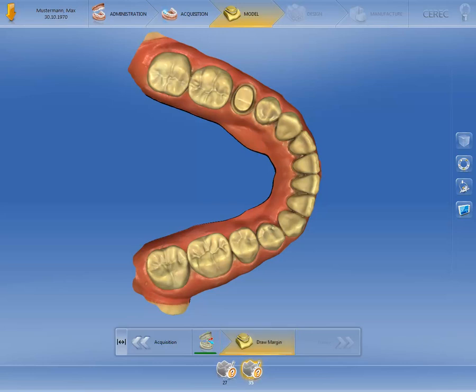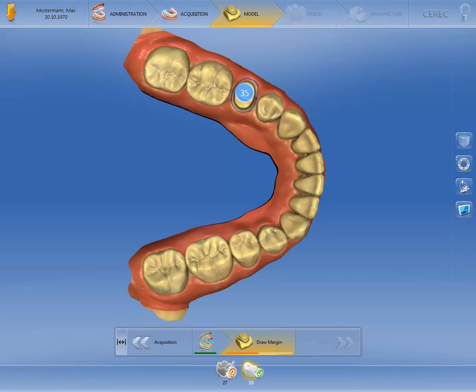In our case, the Preparation Margin must be determined for two restorations. The Preparation Margin for the restoration on 3-5 has been determined and the restoration appears on the object bar with a green check mark. You also receive a message in the step menu that the step has not yet been completed, as the Preparation Margin has not yet been determined for the second restoration. You can see this on the bar with only half of it highlighted in orange.